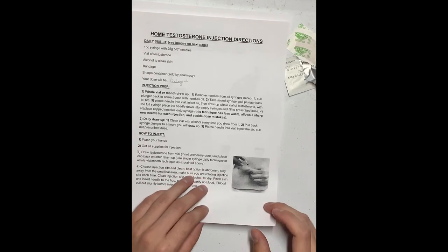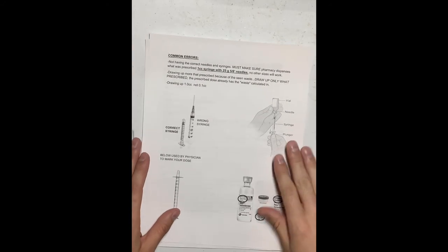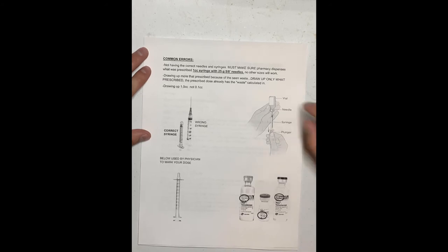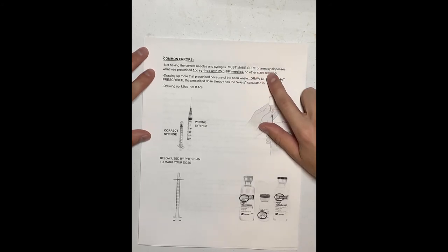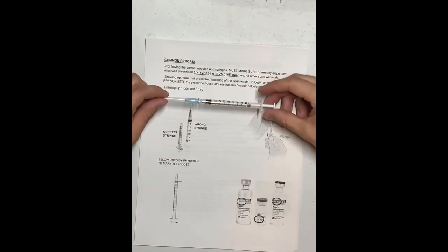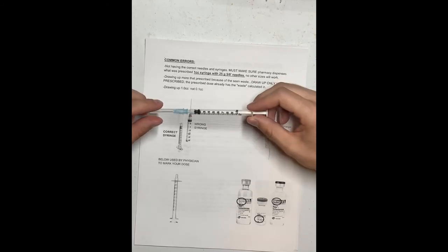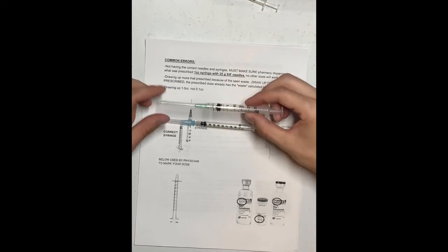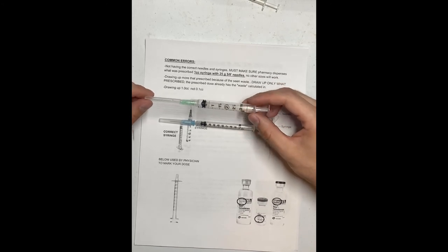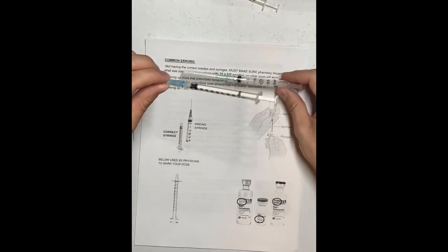Now, some common errors. Number one: not having the correct needles and syringes. You must make sure the pharmacy dispenses what was prescribed — the one CC syringe with a 25 gauge 5/8 inch needle. No other sizes will work. Do not inject with the larger needle. It is very important: inject with the small needle only.